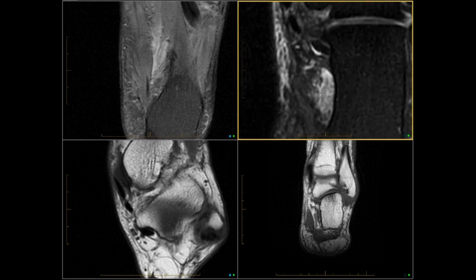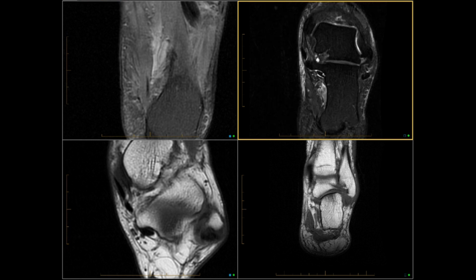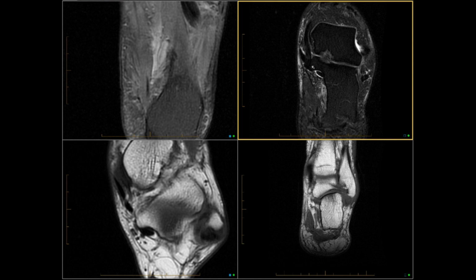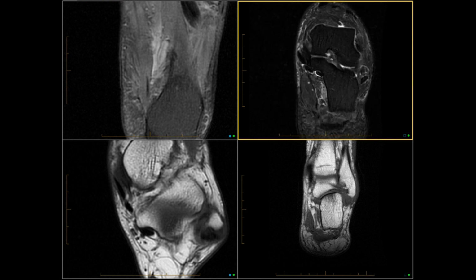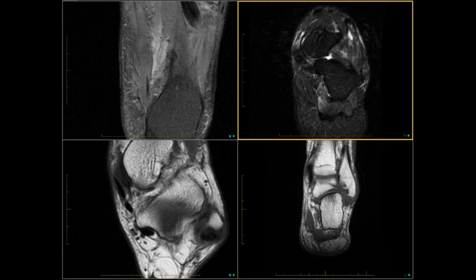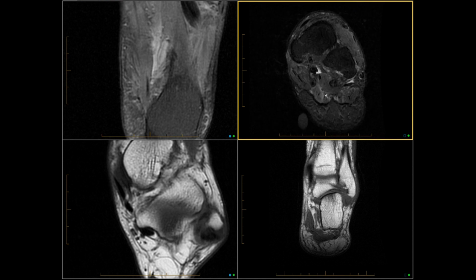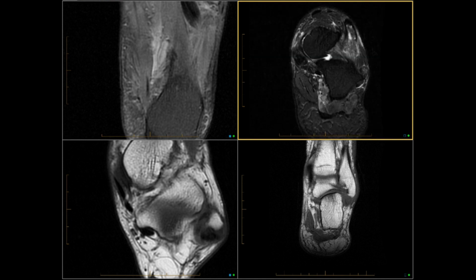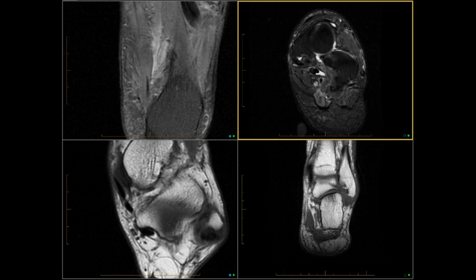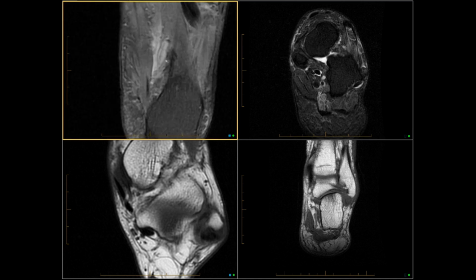And we begin to see moving into the tarsal tunnel. So we have our posterior tibial, flexor digitorum, and our flexor hallucis. The flexor hallucis is always located under the sustentaculum tali, so it's something that you can always identify. And what we're seeing is that as we come towards this region of these muscles, we have some kind of enlargement in this tubular fashion, which seems to be near the neurovascular bundles. Some choices for what this can be are an enlarged nerve or even plantar vein thrombosis.